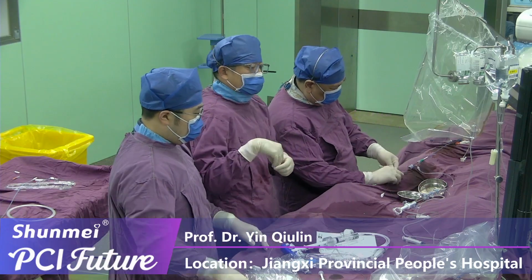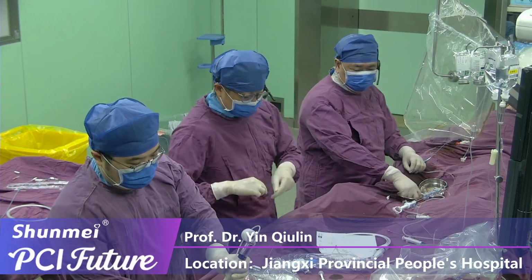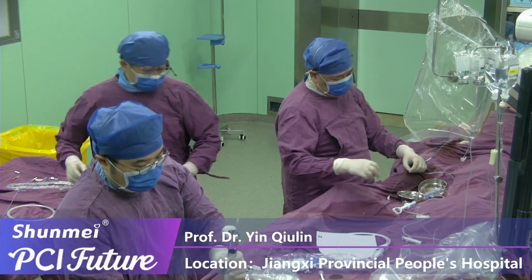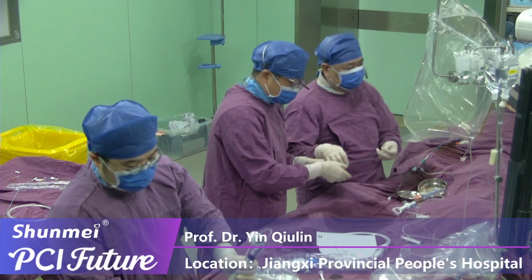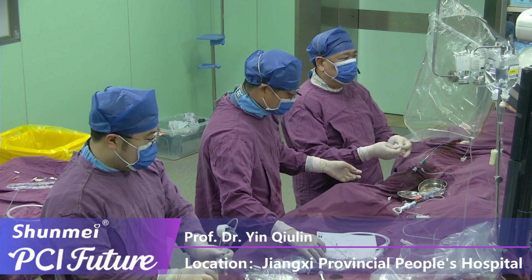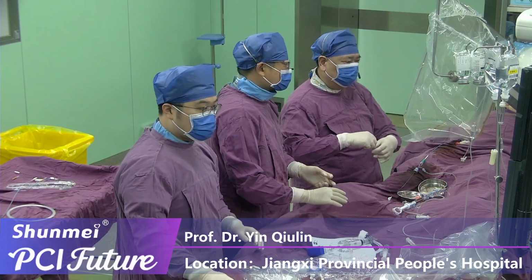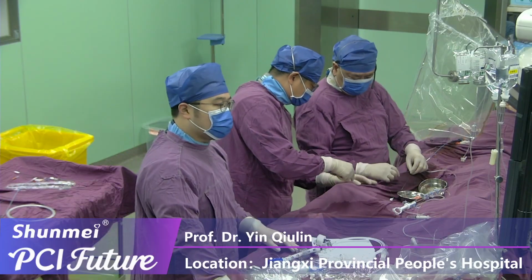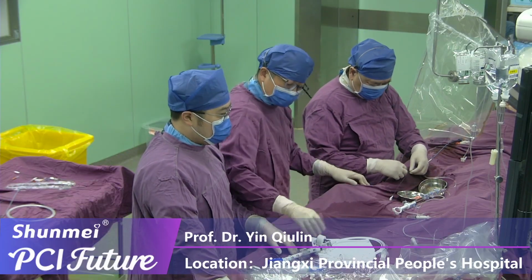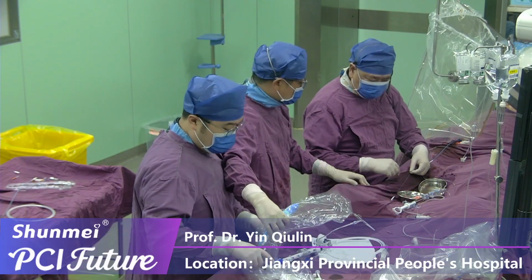The angiography findings: LM, no stenosis at the ostium, and 50% to 60% stenosis in the body and distal segment. LAD, approximately 80% diffuse stenosis with calcification in the proximal and middle segment, TIMI flow grade 3. LCX, approximately 70% diffuse stenosis in the middle segment, TIMI flow grade 2.